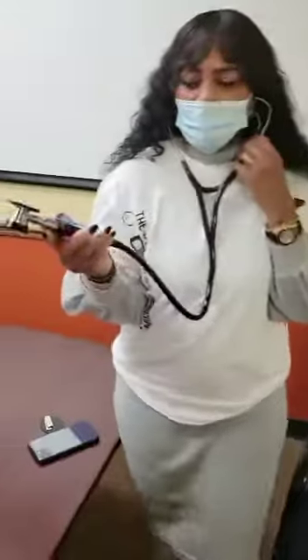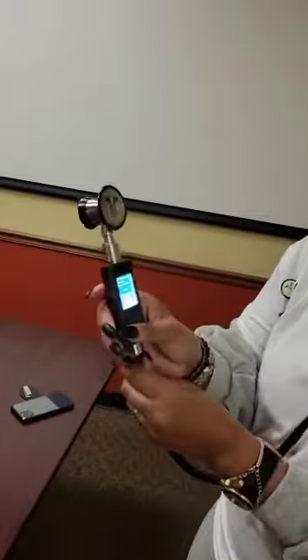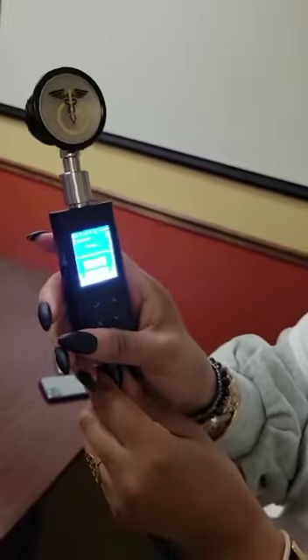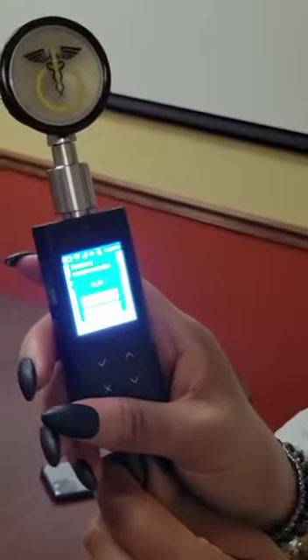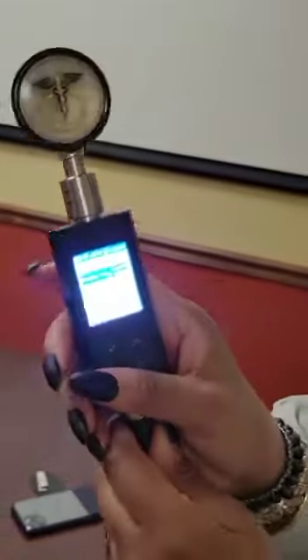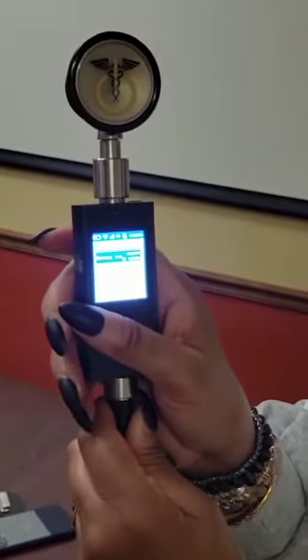So as you can see, within seconds it shows us S1, S2. Next we're going to save this information and you can always go back and listen to the sound again — it shows again S1, S2, the original sound we heard. We're going to exit out of that and save it to our records. You can go back and listen whenever you want.